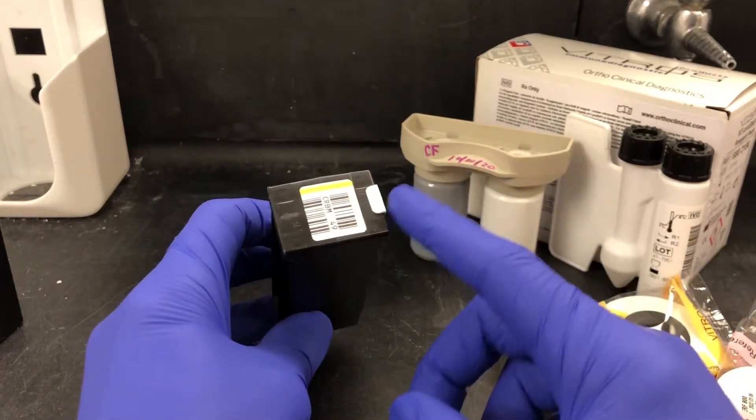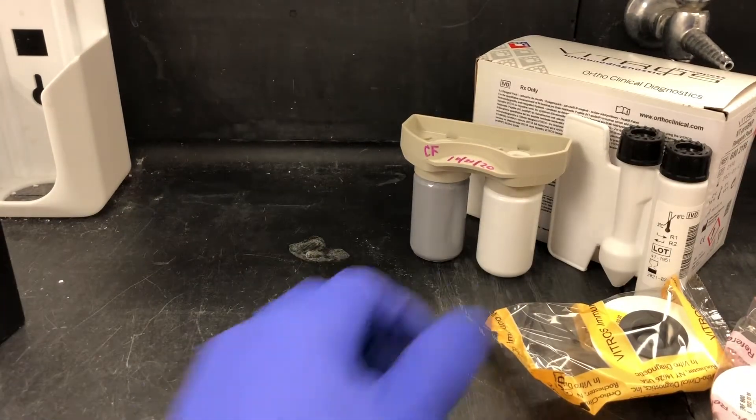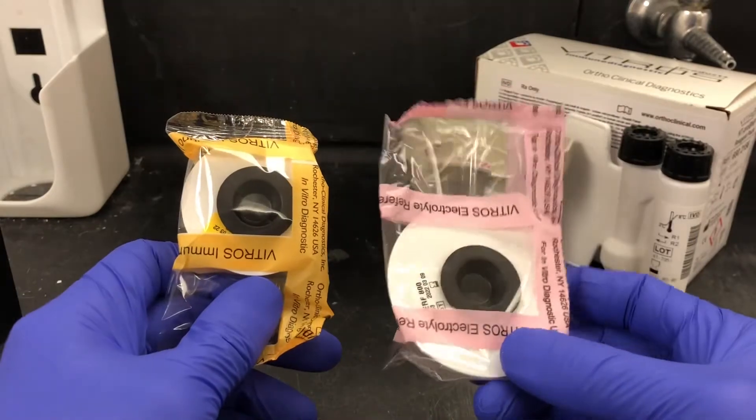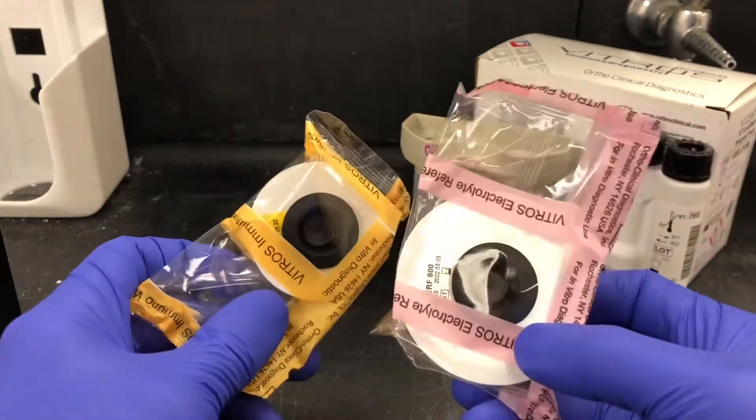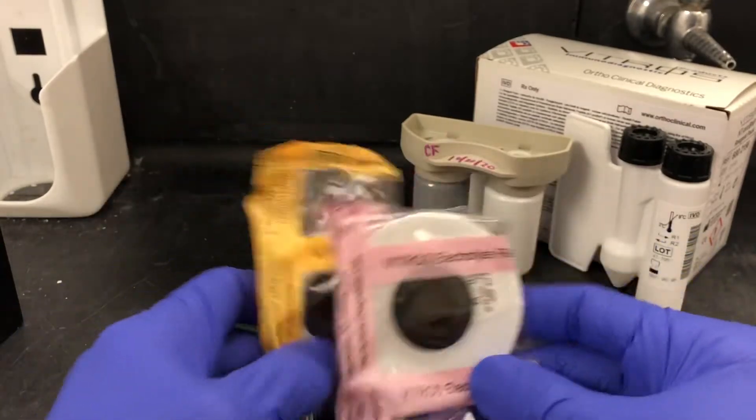This is what the microslide cassettes look like. Some of them have this little white tab, and you have to remove that. We also have some consumables: electrolyte reference fluid and immunowash fluid. These just need to sit out for 15 minutes before you put them on the analyzer.